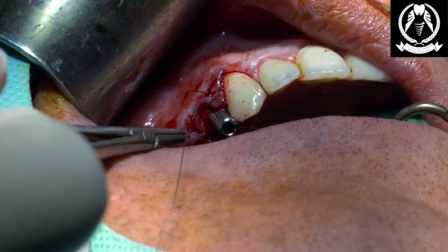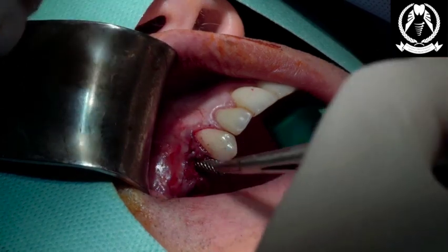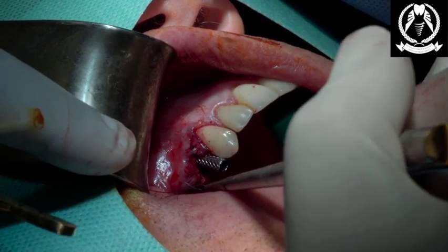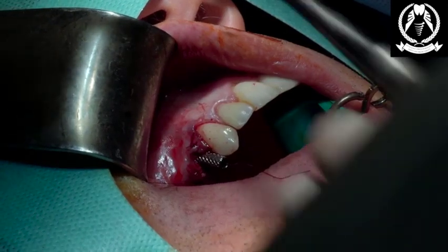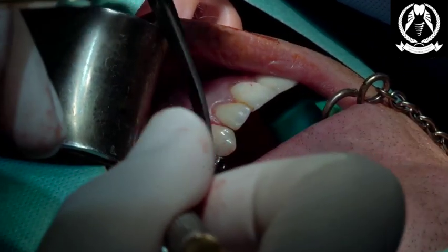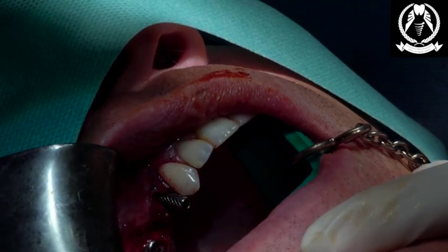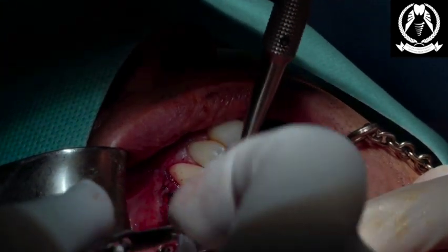There we go. Don't think that's through. Just to seal that. There we go. This loop. Is that closed? Good eye, mate. Yeah? Awesome. Just checking. Maybe one more across there. Okay. Last stitch on this side, Alan, okay? We're home free. I know. I clocked that.